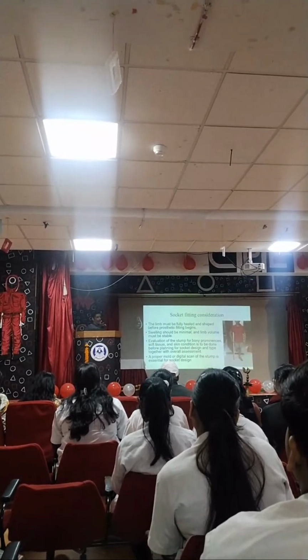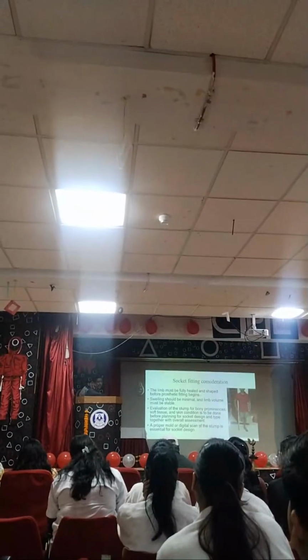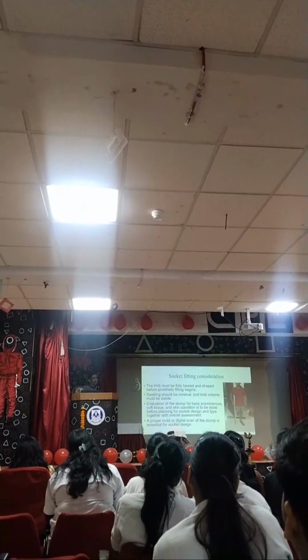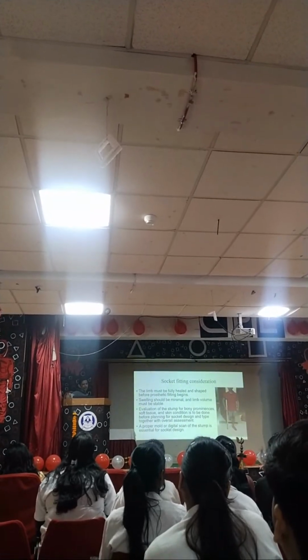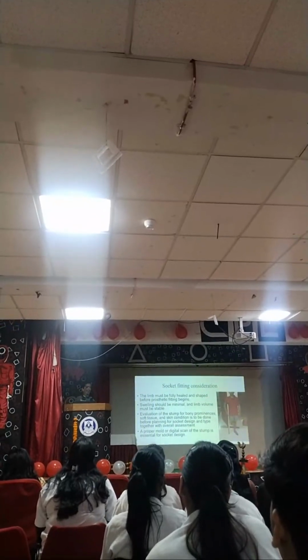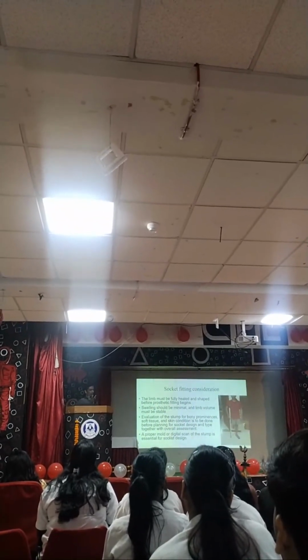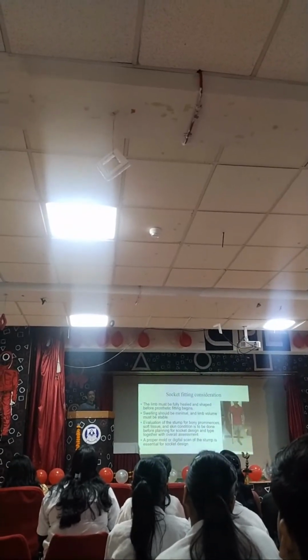Or patient part, after getting consent, and then we further deal with the physical examination in order to know the range of motion, muscle power, contracture, if it is there. So these are small but important things. They are going to create a good amount of information for us to understand the socket design. But this is not enough here.